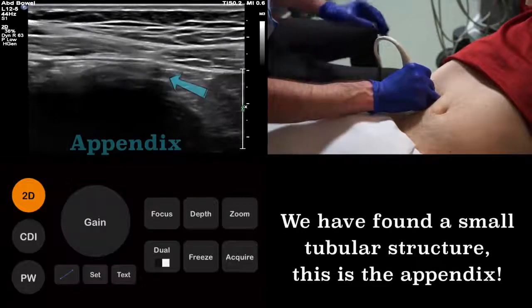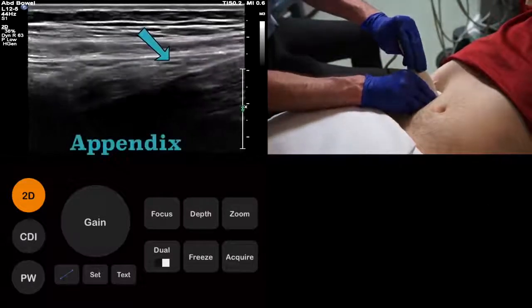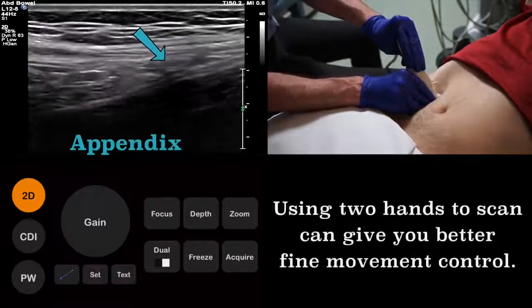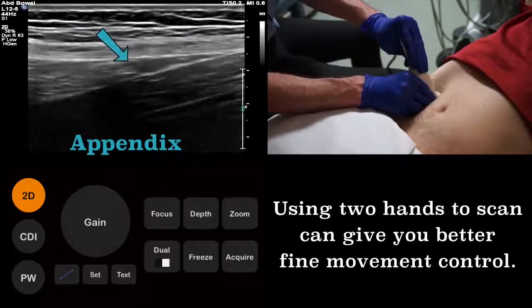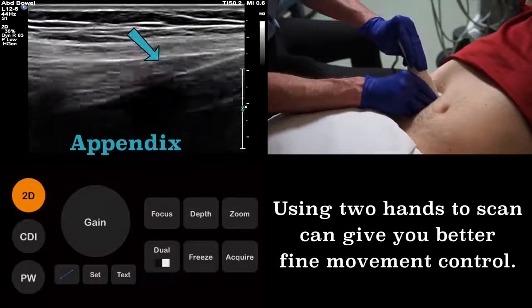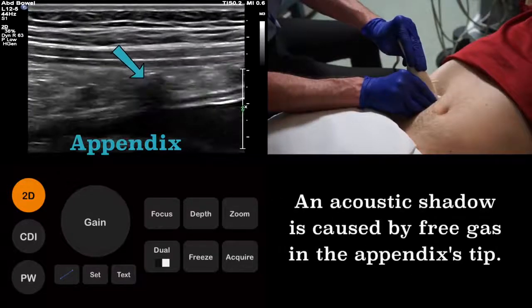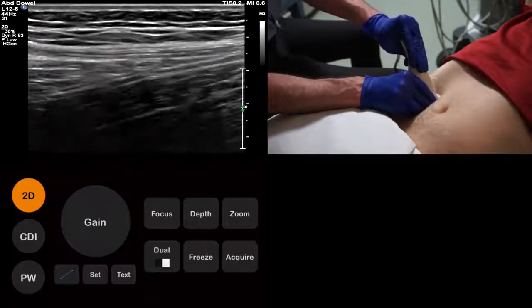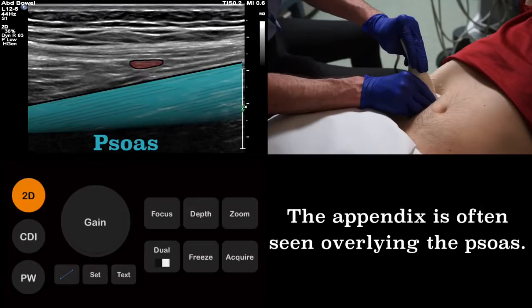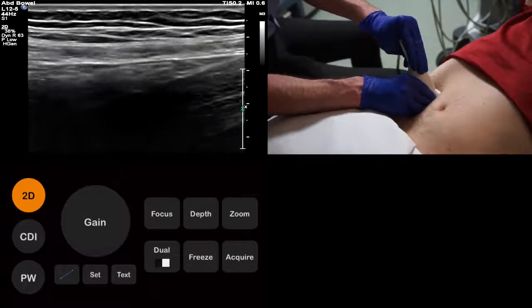Having found the appendix, we must now image it in its entirety. As the appendix is small, using two hands to fine movement control is a useful strategy. At the tip of this appendix, we can see acoustic shadowing, as there is some gas trapped within it. A useful anatomical landmark is the psoas muscle. The appendix will often be seen overlying this structure.